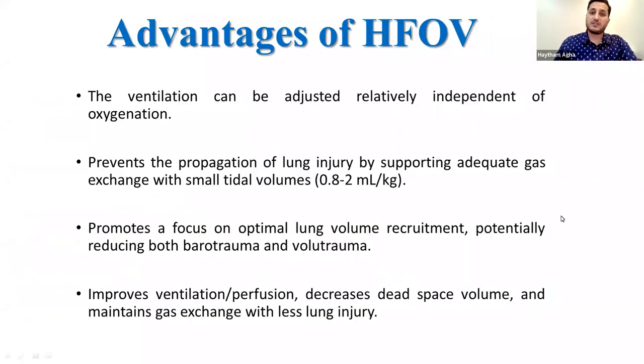Advantages of high frequency ventilation. One of the major advantages of high frequency ventilation is that you can adjust ventilation apart from oxygenation. If you increase, by the way, the pressure on conventional mechanical ventilation, this will wash out CO2, but on the other hand, it also affects your saturation. But in high frequency, you can control every part of the ventilation and oxygenation independent of the other part. Second, you give a small tidal volume, so we are making sure that the lung cannot be further injured by this low tidal volume. High frequency oscillatory ventilation is also a good way to recruit the lung, and by this recruitment, you will decrease the dead space, and by decreasing the dead space, you will improve both ventilation and perfusion.